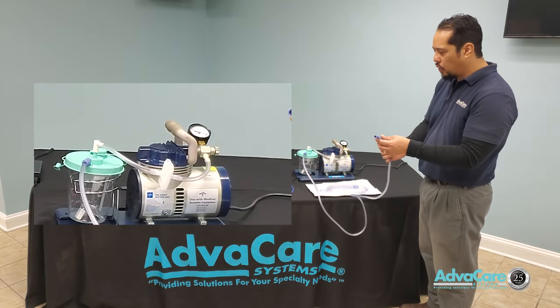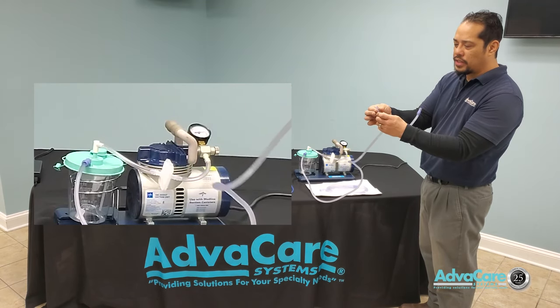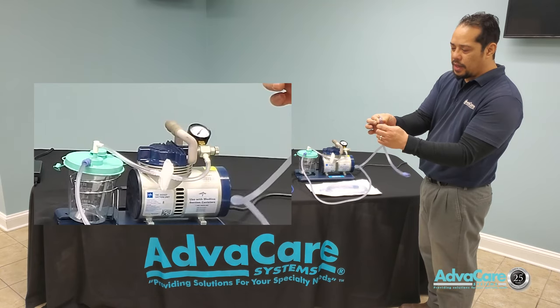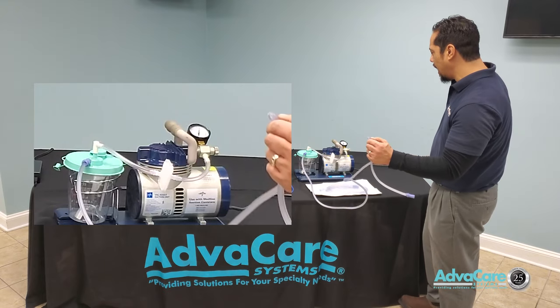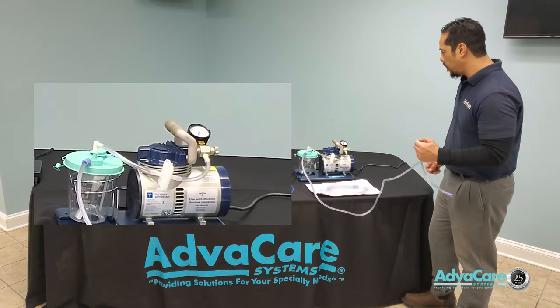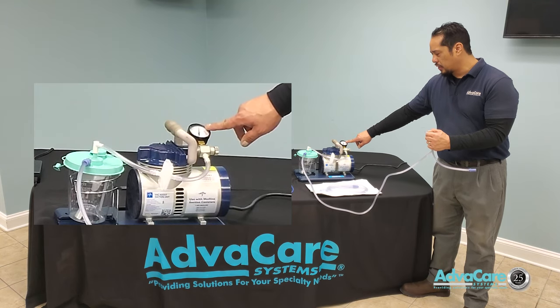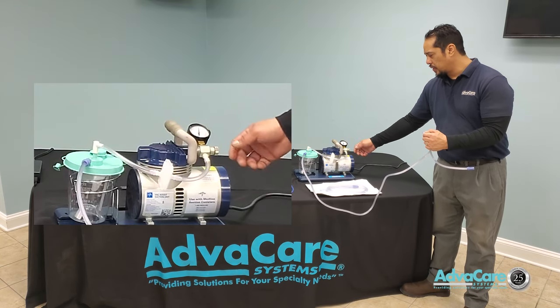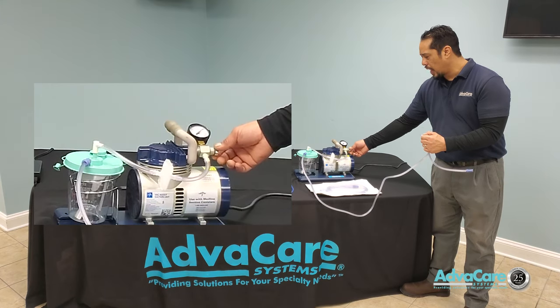You will need to close the circuit by taking your tubing and folding it in half, causing a kink in the line. That kink will imitate a fluid buildup, and you will then be able to see your actual true pressure setting on the suction machine.